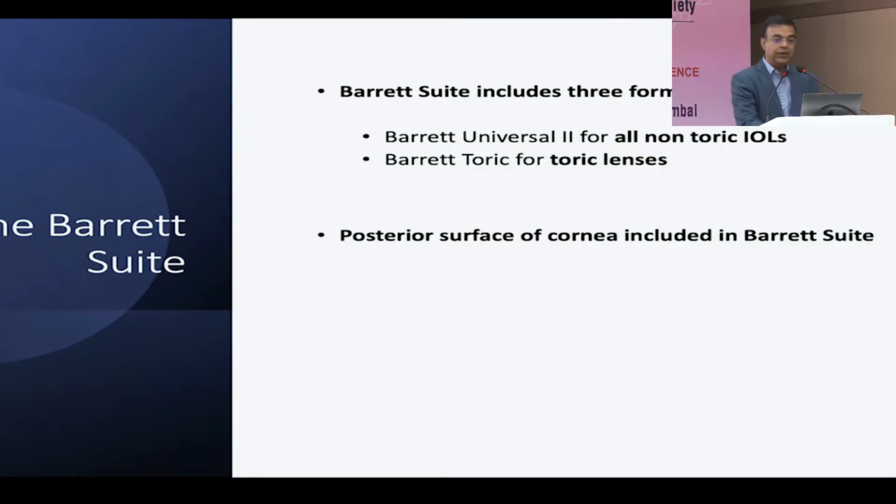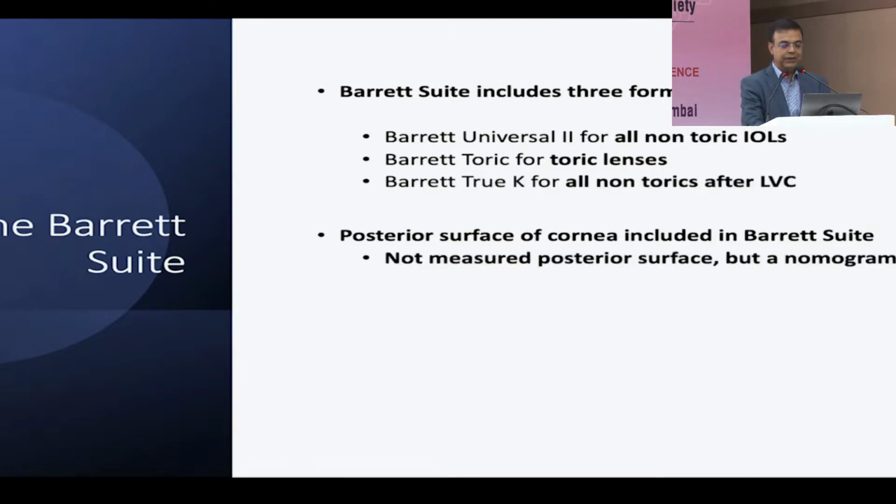And then the Barrett's toric calculator, which is really popular, and I use that for all my toric lenses. And the Barrett's True-K for all the non-toric, especially in post-refractive surgery patients, is again my go-to formula for post-refractive surgery. Dr. Sheetal will be talking on that soon.